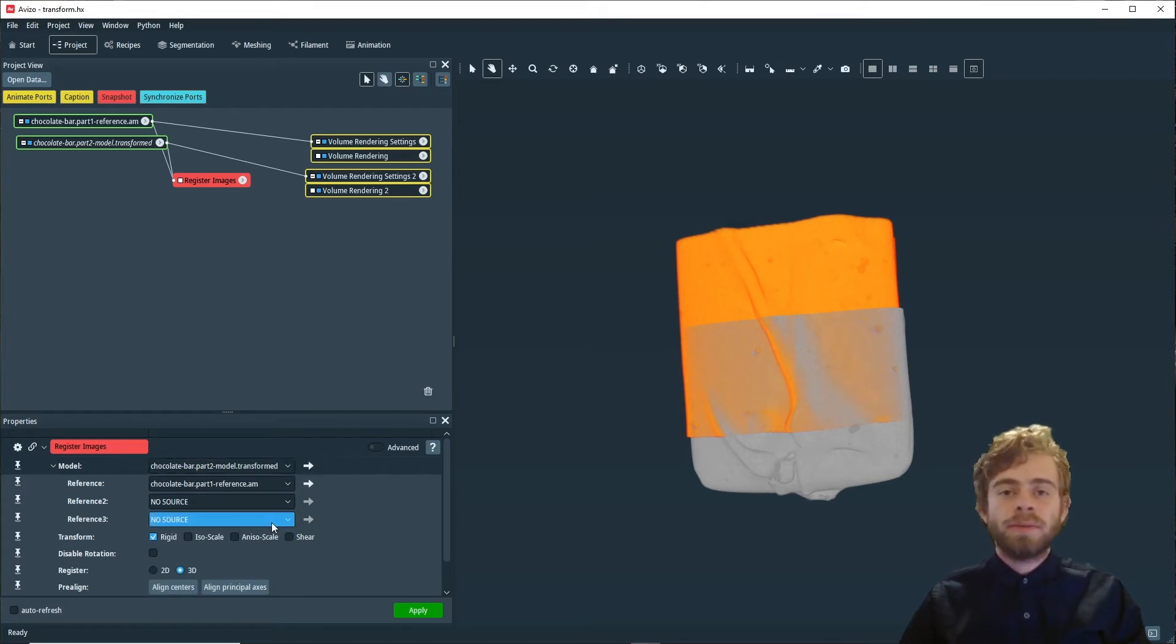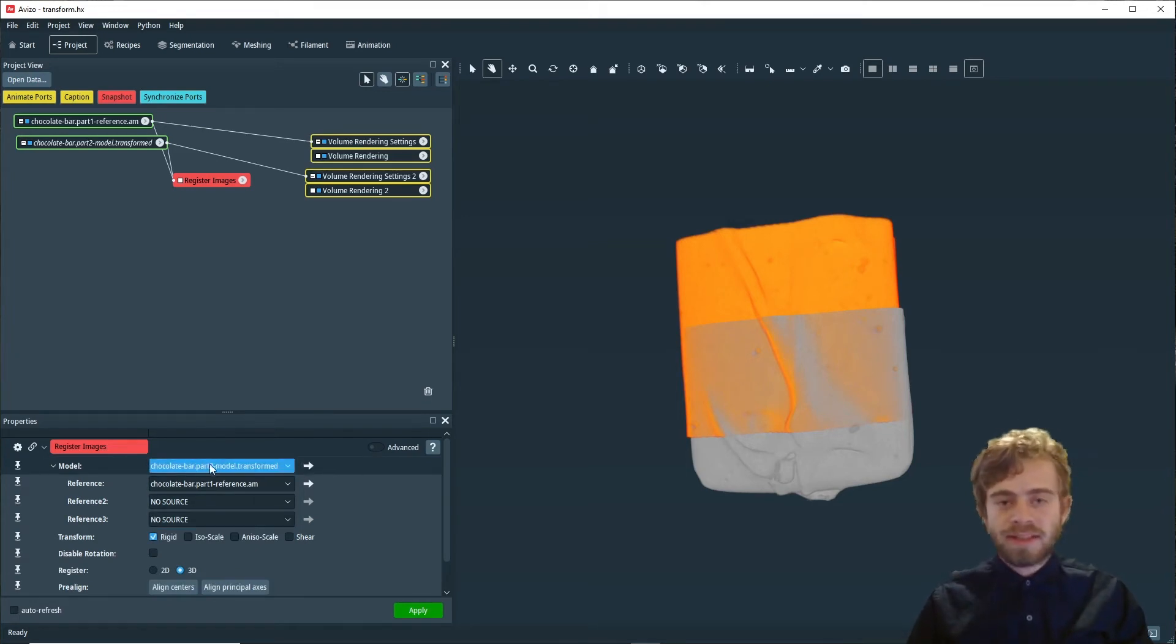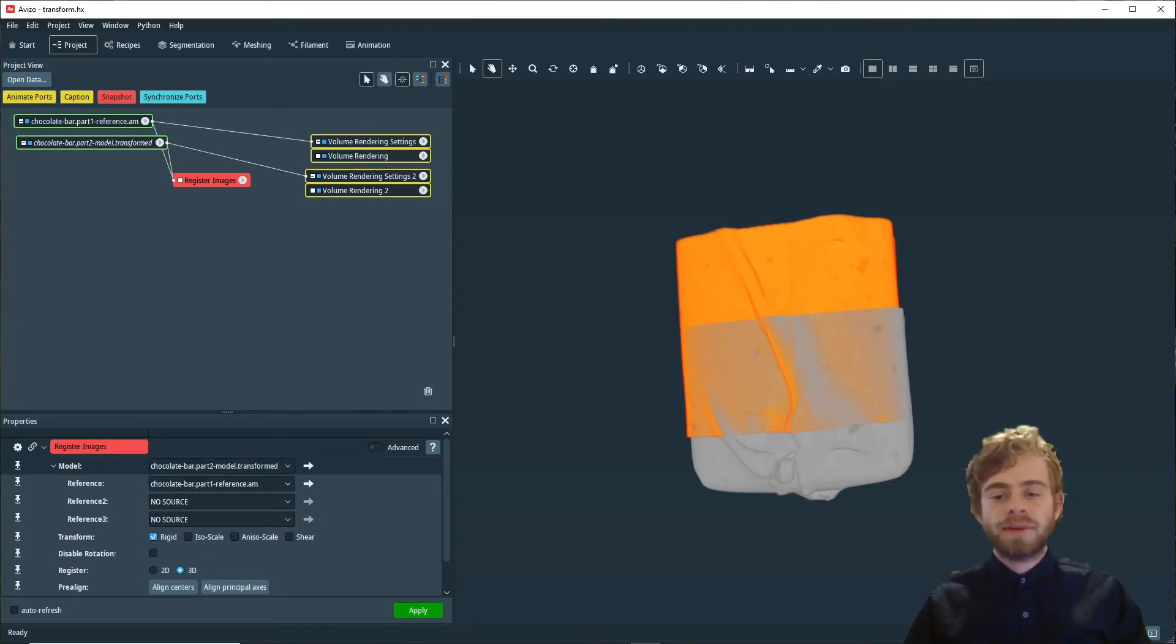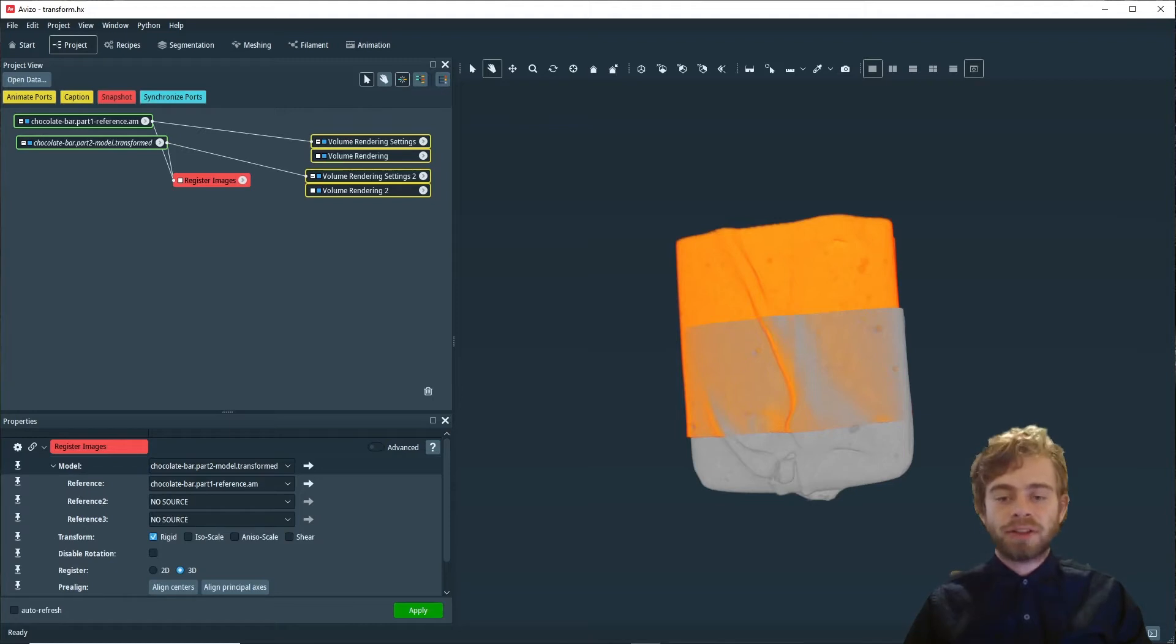The dataset in the model port is the dataset that will be moved to match the datasets in the reference port. In this case, the orange part of the dataset is the part that's going to be moved to match the gray part.